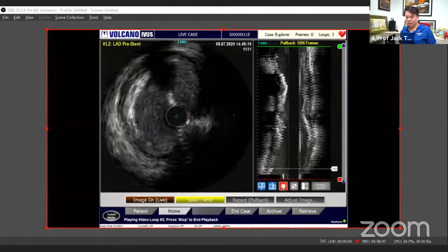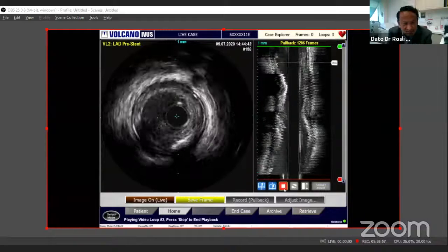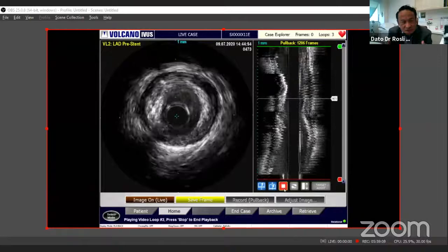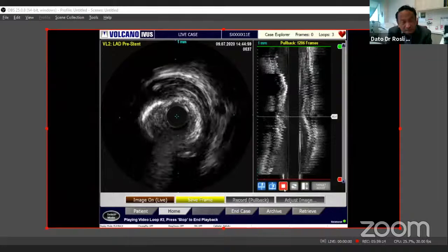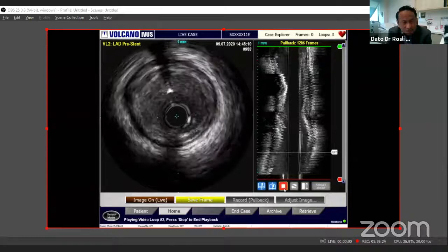The rest of the faculty? One of the things that is also seen, as we see in ostial lesions, is that they tend to be fibrotic and calcified, as seen in this case. And that tells us that we must prepare the lesion very well. The reason is that with a two-stent strategy, the risk of coming back is usually at the ostium. So you need to ensure that you prepare the lesion very well, and then when you stent it, make sure that in the end you go back with a non-compliant balloon. That extra work of getting the stent well expanded in the ostium plays a big role in reducing the risk of restenosis in the future.